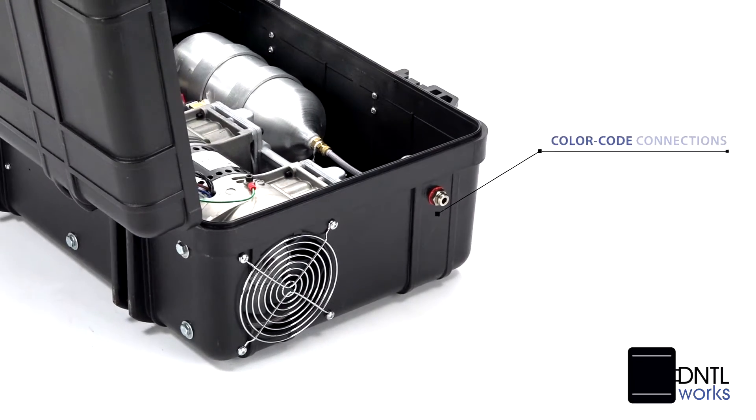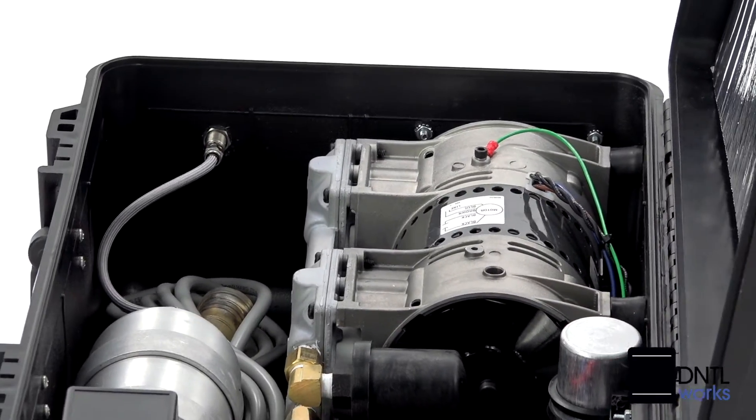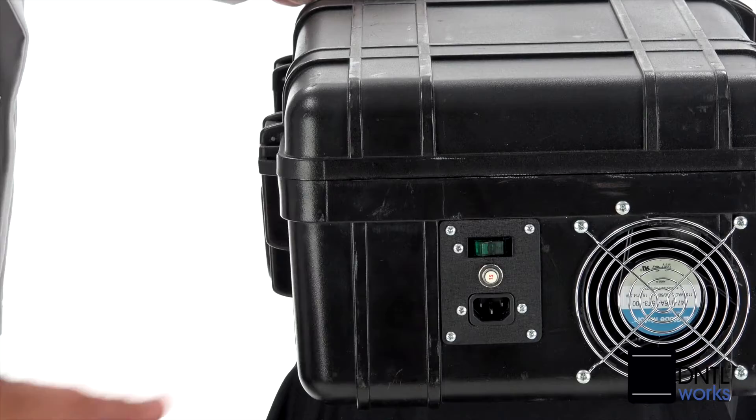High-quality color coat connections allow easy identification, training, and operation. You get a one-quarter gallon air reservoir, a 120 volt power supply, plus hospital-grade wiring with 15 amp circuit protection.